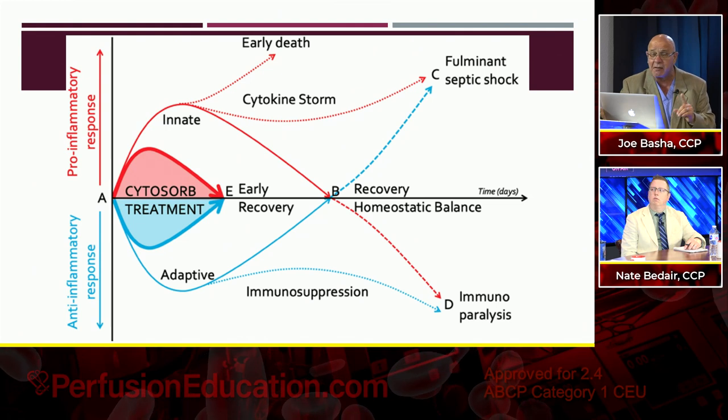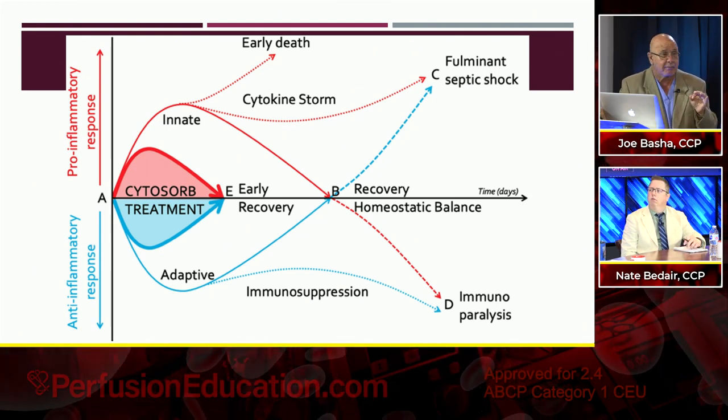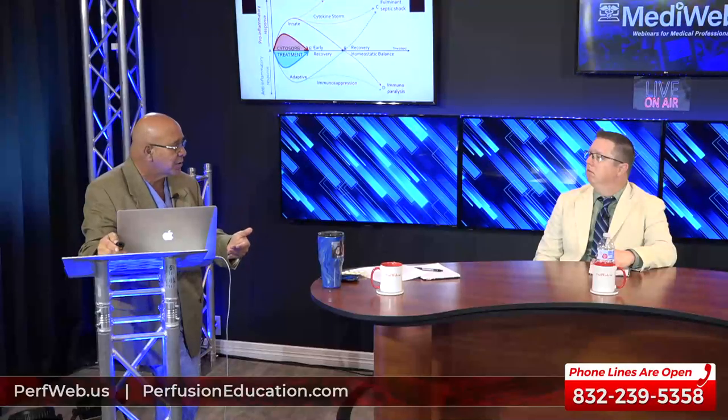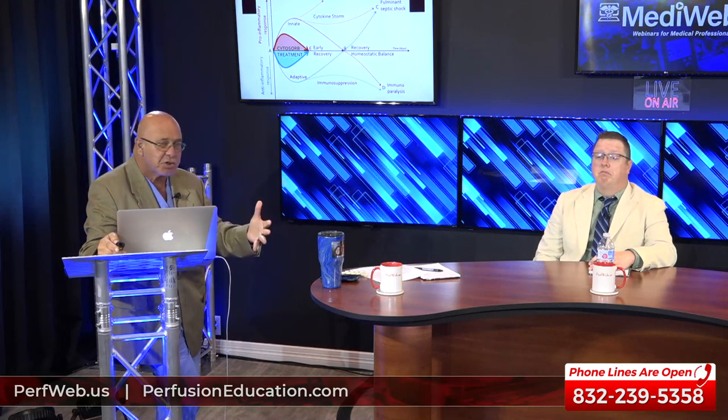Now, interestingly enough, I heard Baxter has recently come out with a filter that, I'm assuming they're using heparin, but they have some type of charge on the fibers now, which will adsorb, it gives a charge that will draw these inflammatory mediators to it. I'm not sure of the cost. I know CytoSorb is very expensive, and you have to use them, I think, every day. You change them for a period of time. They're about $6,000 or $7,000 a treatment. They're not cheap, they're very expensive.